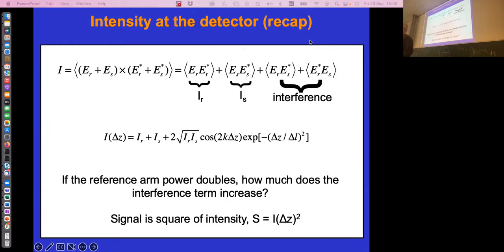You know what a Mach Zehnder is? Okay, this is my incoming beam. This is a beam splitter, which splits the beam into this half and this half. These are two mirrors. They reflect the light back to the second beam splitter, and this is my outgoing beam. This is a Mach Zehnder, and in principle, it's very similar to a Michelson interferometer, where this would be L1. L1 is this path here, and L2 would be this path here.